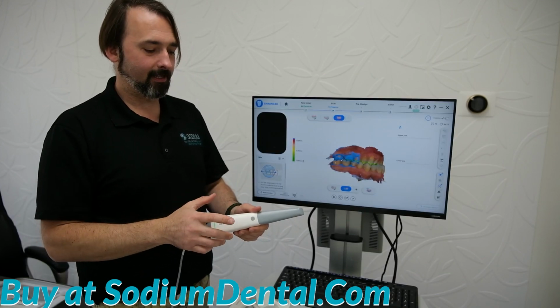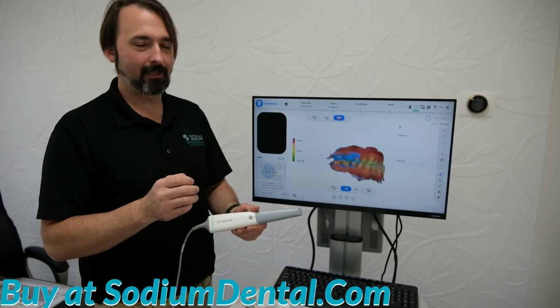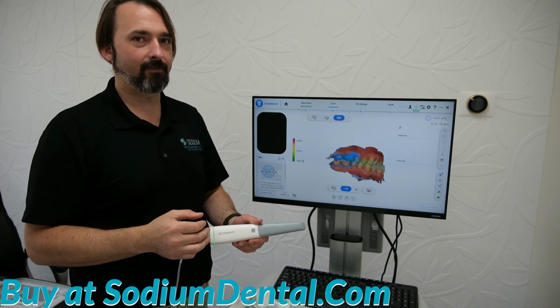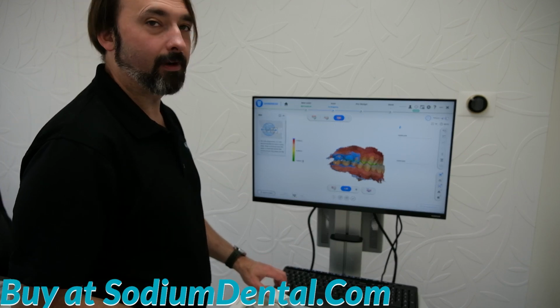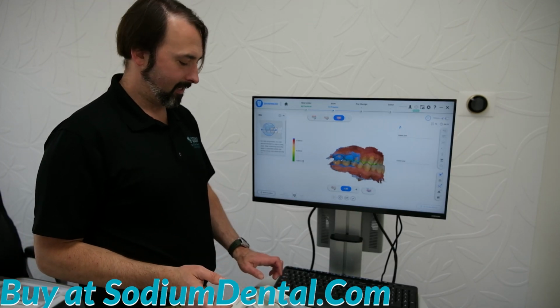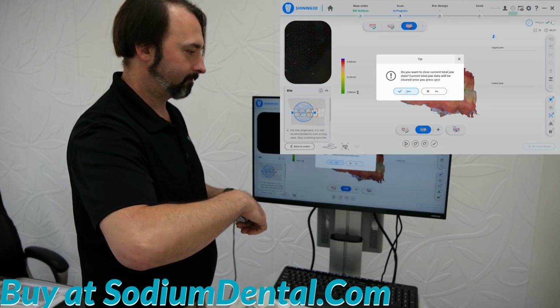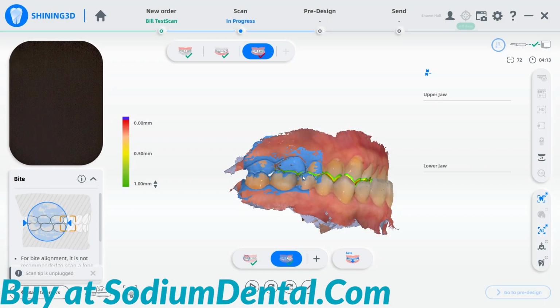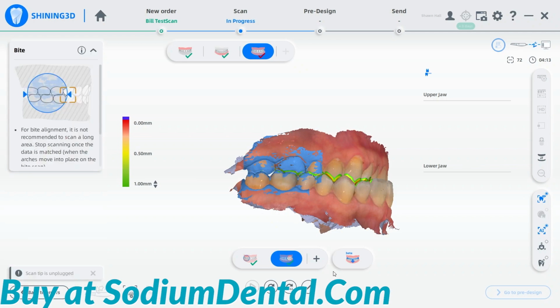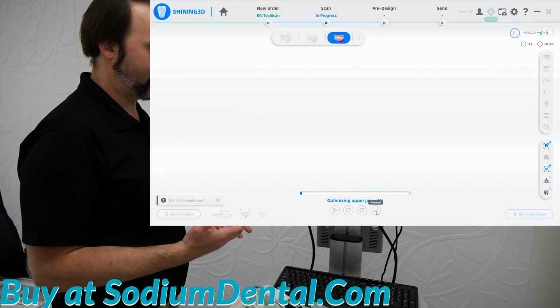Once both jaws come together, I press the scan button again to stop the scan before allowing the patient to open or retracting the scanner from the mouth. You have completed your intraoral scan. At this point, you can remove the scan tip. You can press the check button to mark the scan as finished, and it'll begin optimizing the data and putting together your scan.